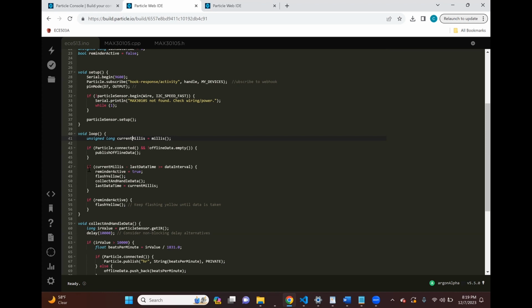Then next, we check if the current time compared to the last time is greater than 30 minutes. And if that's true, we set the reminder to true, which flashes the LED yellow. And then we collect and handle the data, and we update the last data measurement time. Then if the reminder is active, of course, we flash the LED yellow to remind the user to take a measurement.